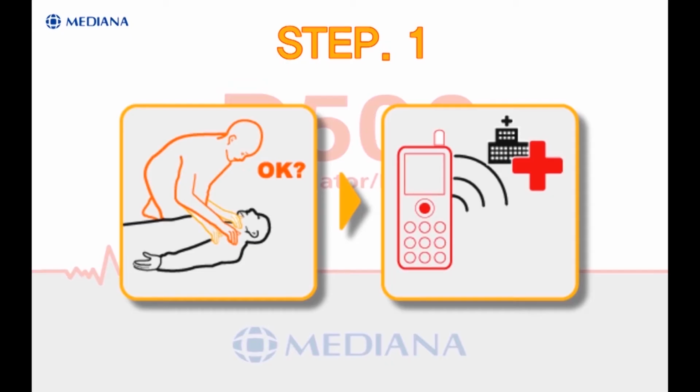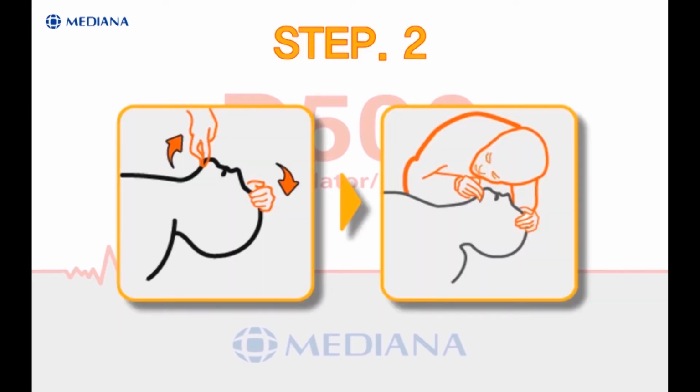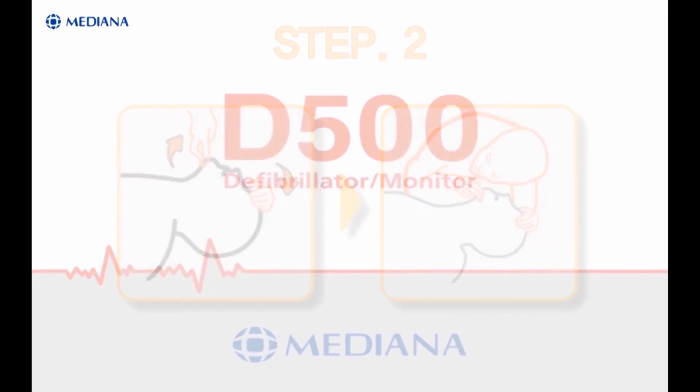Are you all right? Call for help. If pads are connected to defibrillator monitor during step 1, defibrillator monitor will go on to step 4 directly. Open the airway. Check breathing. If pads are connected to defibrillator monitor during step 2, defibrillator monitor will go on to step 4 directly.